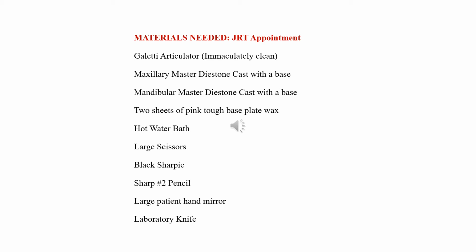So one of the things that the dental assistant must do, and it's almost always, I would say, 90% of the time I'm asking for something extra because the assistant forgot something. And so you should memorize this list so that when I walk in, everything that's needed is right there in front of me. I don't have to ask and wait.